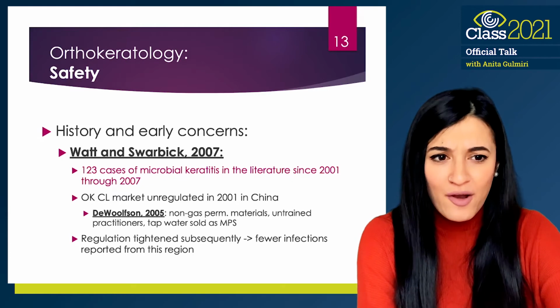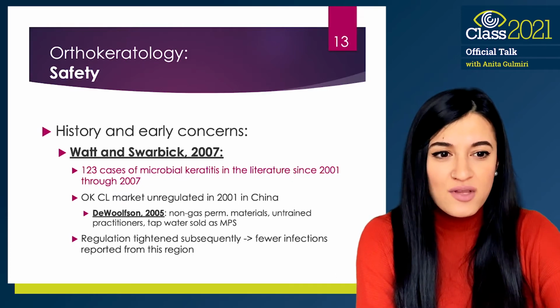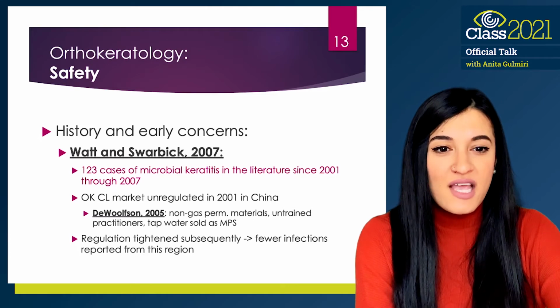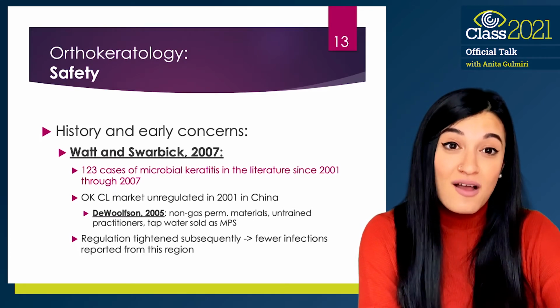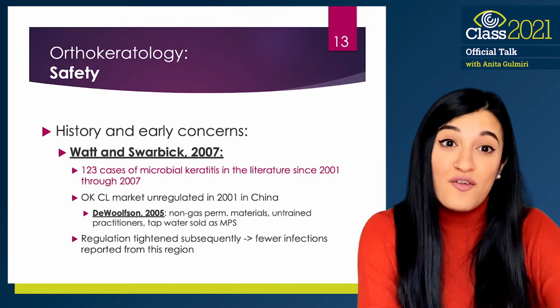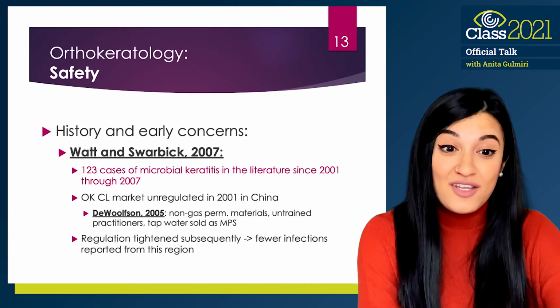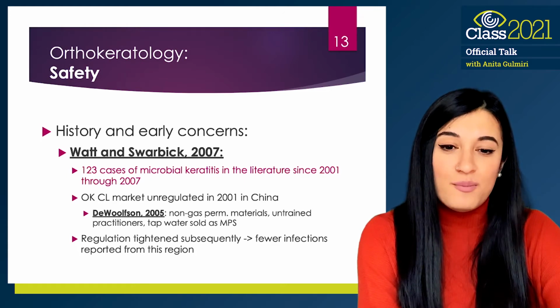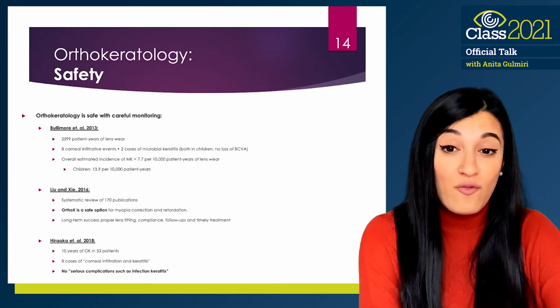So despite this apparent increase in reported cases of microbial keratitis in ortho-K since 2001, many of these cases occurred in a relatively short time frame in East Asia, but it left a lasting impression such that a lot of practitioners even today still haven't been convinced of the safety of ortho-K use. Because several subsequent studies have proven a fairly safe profile for ortho-K.